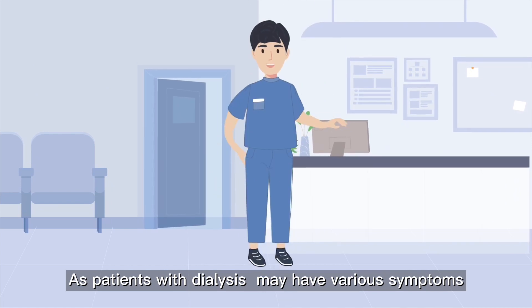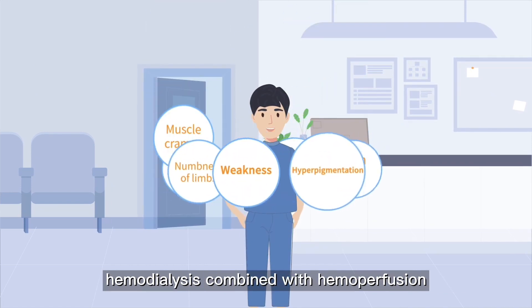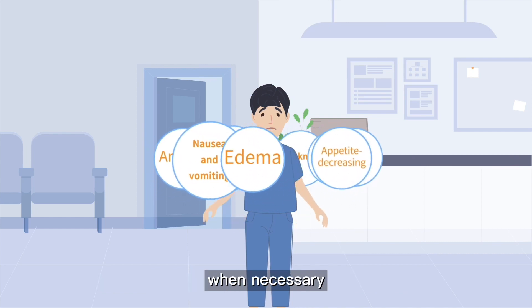As patients with dialysis may have various symptoms, hemodialysis combined with hemoperfusion is required to improve their clinical symptoms when necessary.